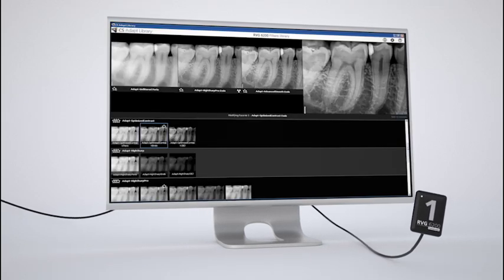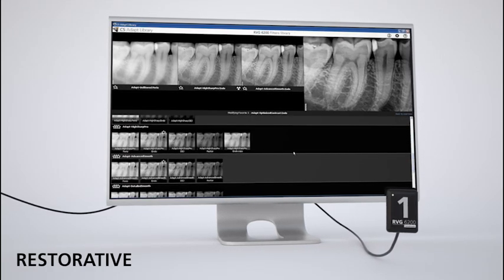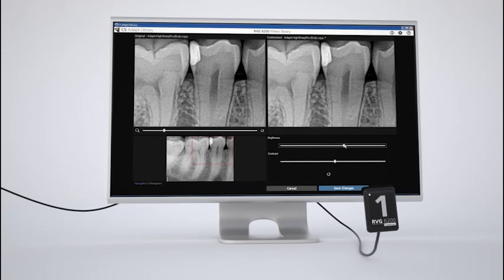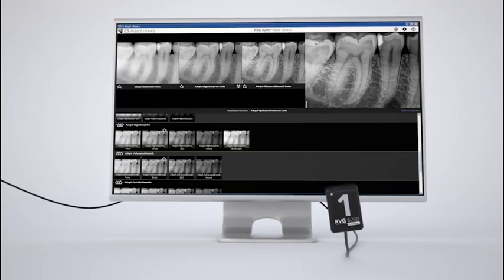It also includes anatomic modes for Perio, Endo, DEJ, and restorative applications, with easy-to-use library-style browsing and selection. You can then easily adjust brightness and contrast and save the edited filter to your preference.